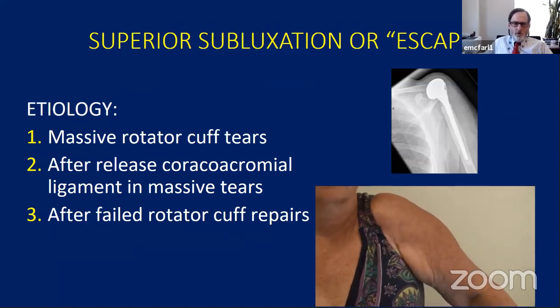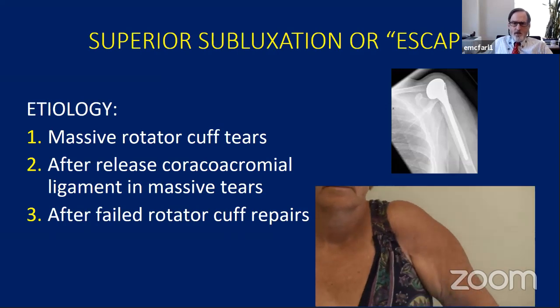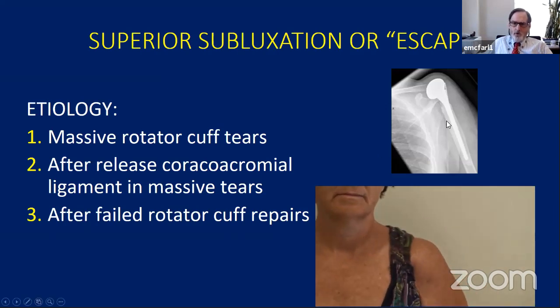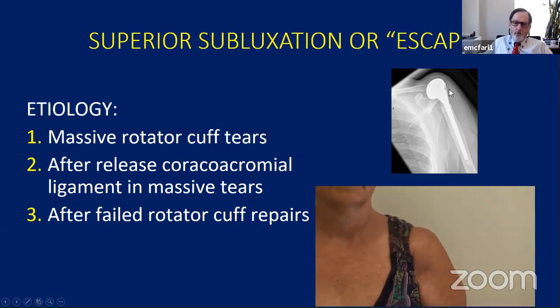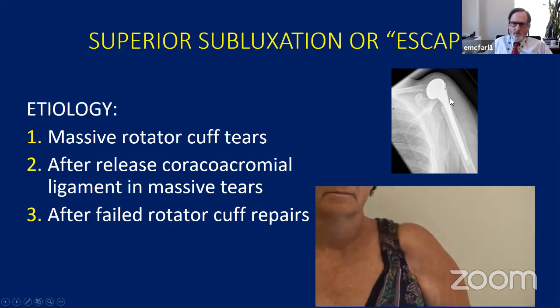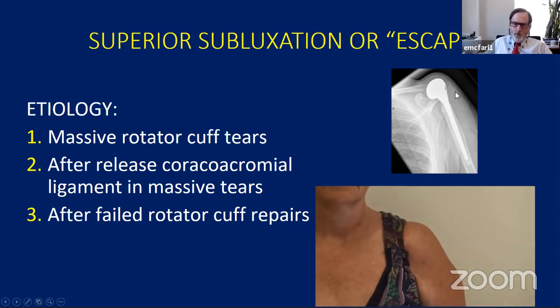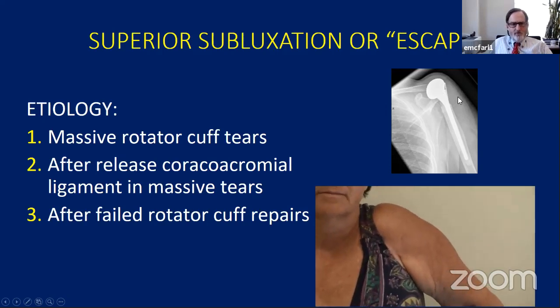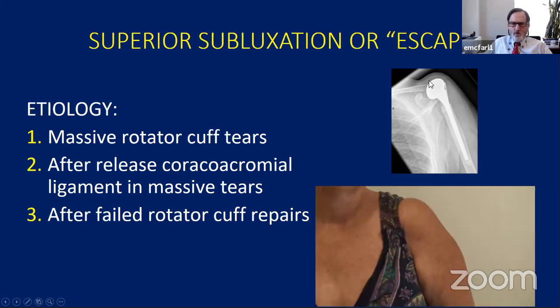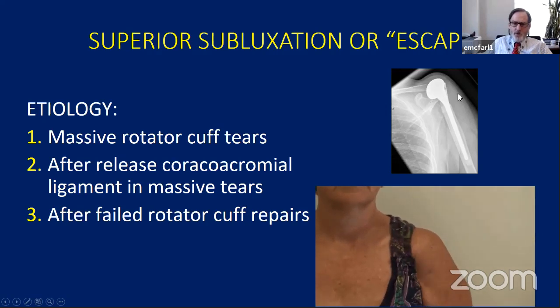One of the major causes of dissatisfaction with a hemiarthroplasty for a fracture is that they get superior subluxation or escape. So you can see here the tuberosities essentially are gone. And it's really important when you do fracture work, if you're going to put a hemi in, that you save the tuberosities. For a while, people, for some reason, were excising the bone and sewing the tendons down. I think bone to bone healing is much better. You also tend to see this sometimes in people who have massive rotator cuff tears, they get this superior subluxation like this, which is somewhat of an extreme example.